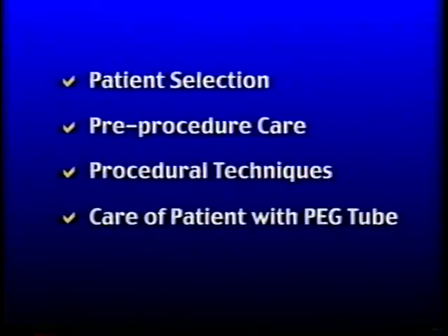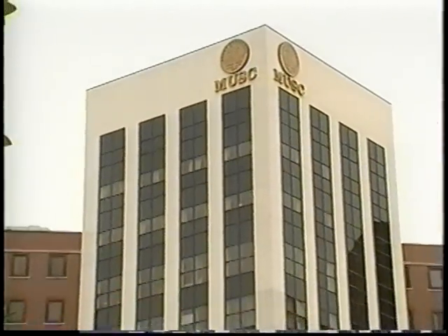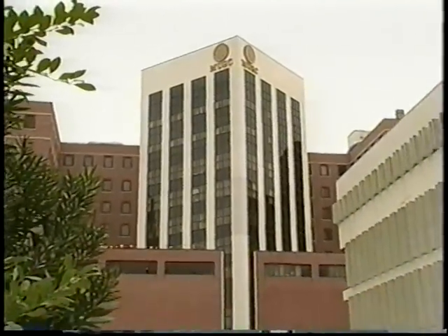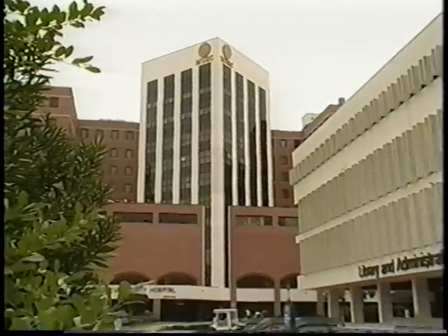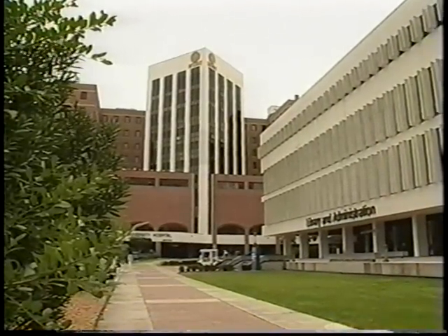tube. Commentary is provided by clinicians at the Medical University of South Carolina, including Dr. Mark DeLegge, Director, Section of Nutrition, Digestive Disease Center, along with Phyllis Malpas, RN, Gerald Chiapponi, RN, and Gregory Buck, PAC.